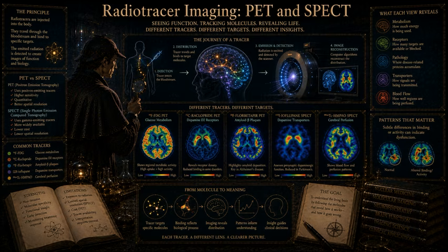However, SPECT has historically survived and thrived for practical reasons. The scanners are much less expensive to build and maintain. They don't require the complex coincidence timing electronics. And crucially, the isotopes used in SPECT have properties that make them vastly easier to manage logistically.